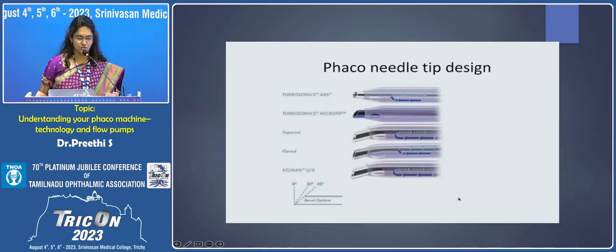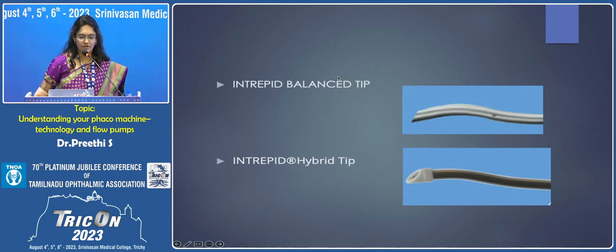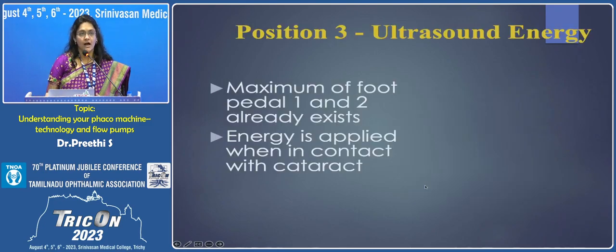We also need to know about the various Phaco tip designs, which we will learn as we go ahead in our career. The current tips are Turbosonics, ABS, and you have a micro tip, a taper tip, a flare tip, and also a Kelman tip. These are all terminologies which we should know. Nowadays, we also have the Intrepid balanced tip with a different design, which has a specific purpose, and the Intrepid hybrid tip as well, which has better cutting efficiency. So this is the latest along with the basics. And then going on to position 3, which is the ultrasound energy.